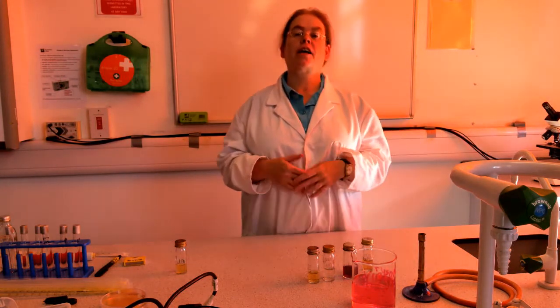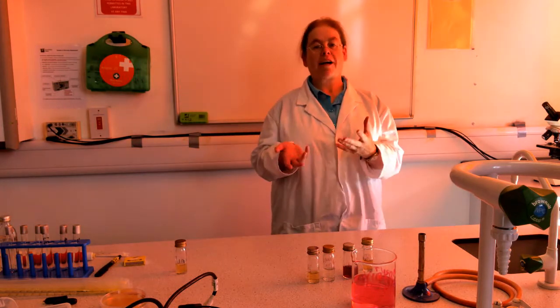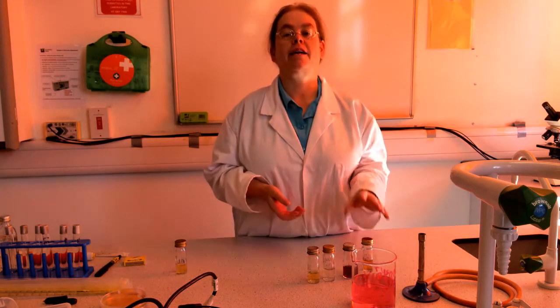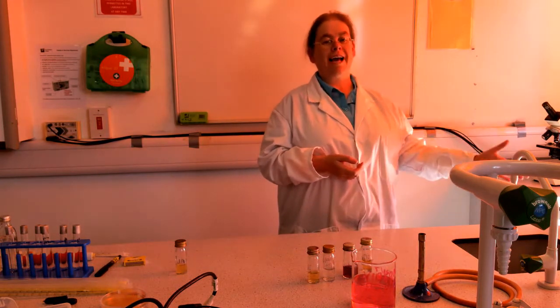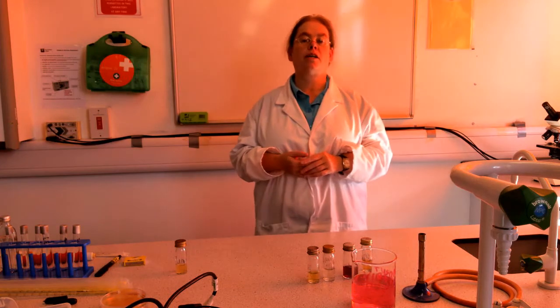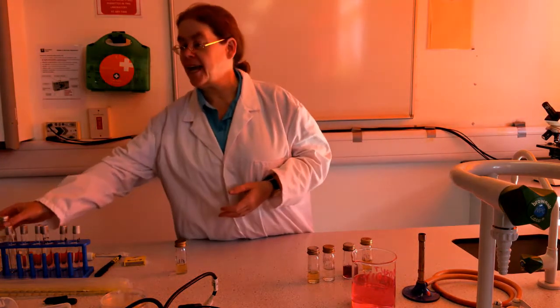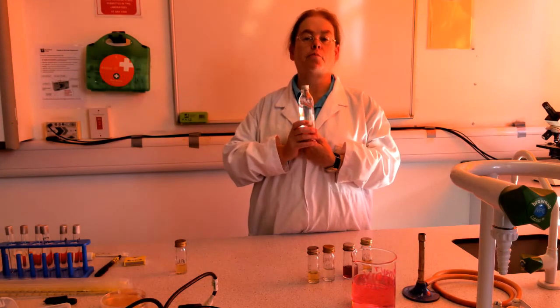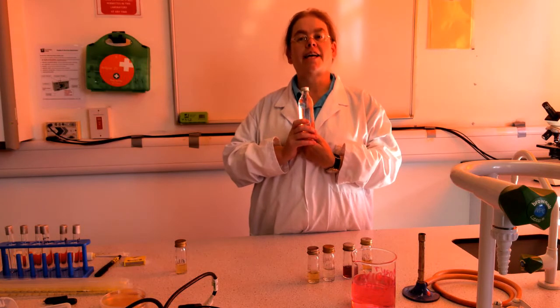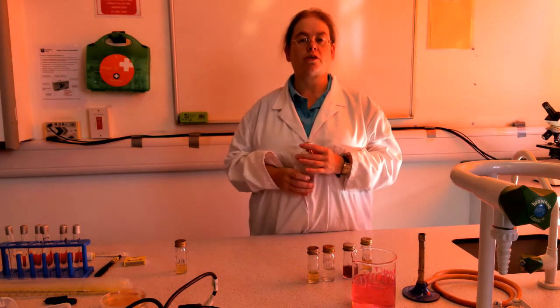So the first thing I would have got you to do, because it's like a 3-week practical, is to make up the solutions. You would weigh out a certain amount of the powder, dissolve it in water, put it in a bottle, such as this, a heat-proof bottle, and then the next step would be to sterilise your liquid by putting it in an autoclave.